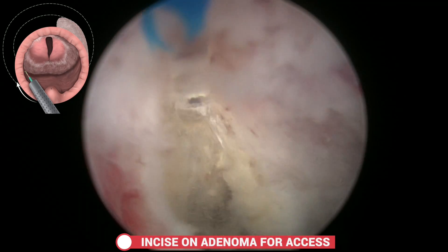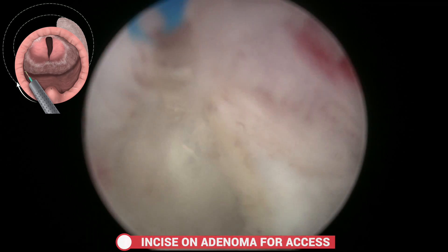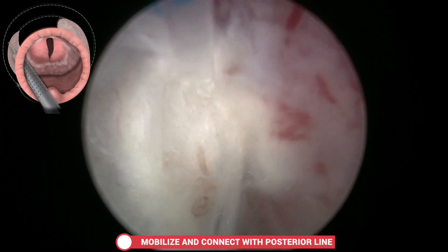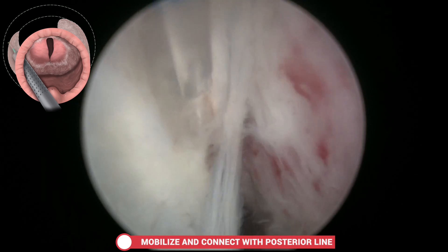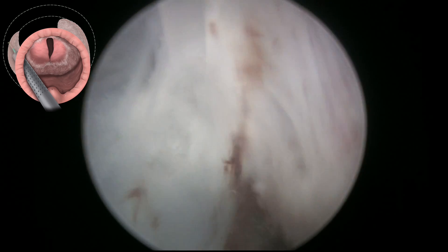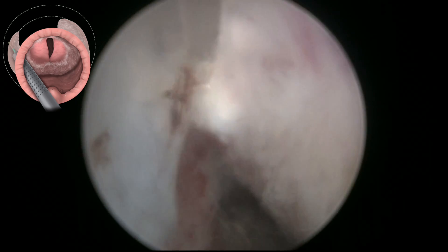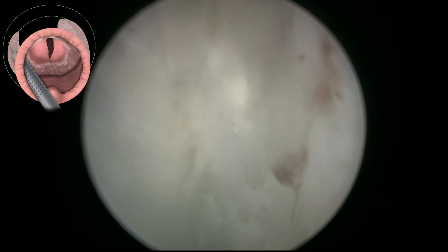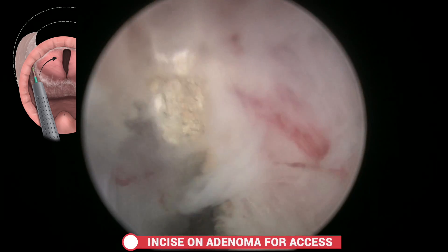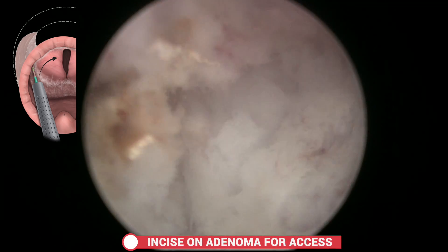Then the same steps are taken on the other side. Initially an incision is made to the white line to deepen it, and this phase consists in mobilising the lateral aspect of the apex and connecting to the posterior line, creating a definite line that goes around the adenoma to guide us during dissection.